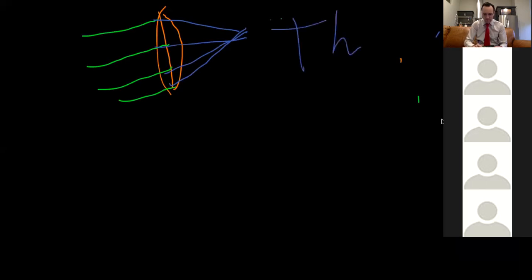Okay, this would be what we're doing with our lensometer conceptually, meaning we have a ray of incident light, and we are assuming that this ray of light is refracting right in the center or the middle of the spectacle, right? So this is not the true power. However, this is how we need to think about lensometry, particularly for our board exam.